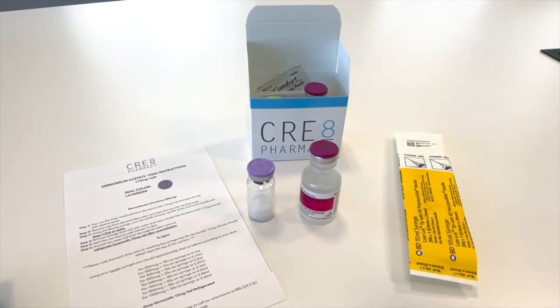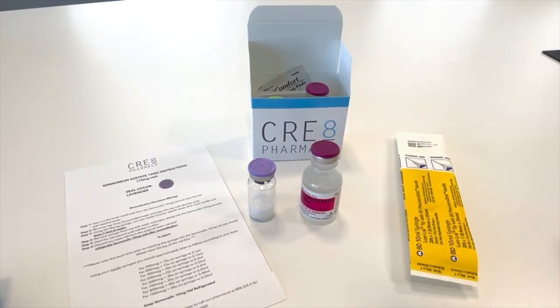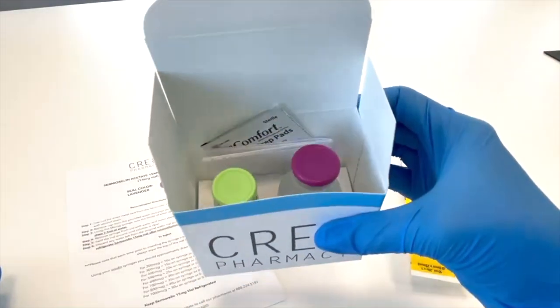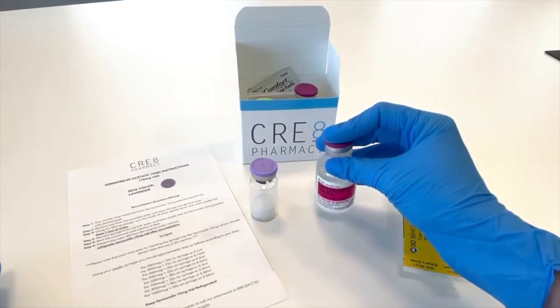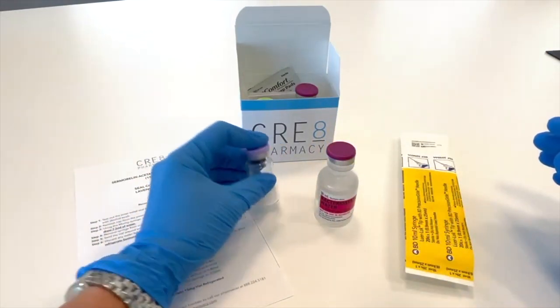Today we are going to show you how to reconstitute one of Create Pharmacy's lyophilized medications. You will be receiving one of our medication kits. Inside these kits you will receive two vials: one of the bacteriostatic water or the sodium chloride, depending on which medication you are receiving, and another vial of your lyophilized powder.